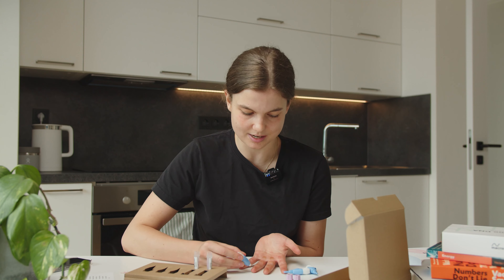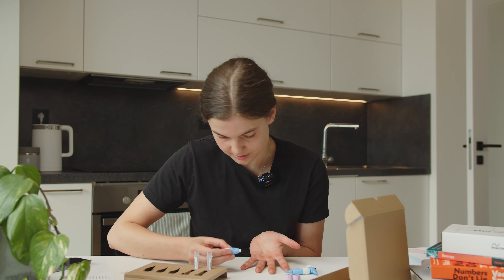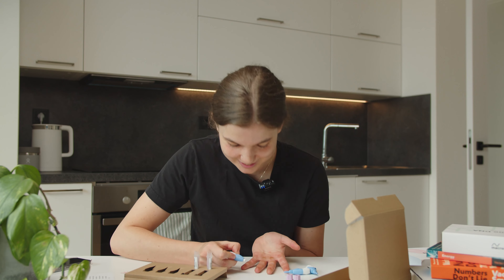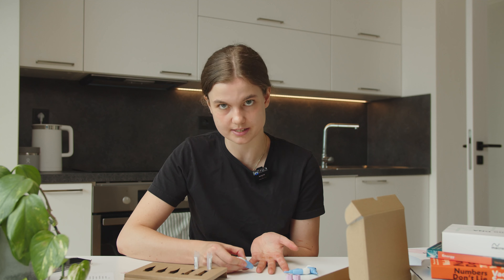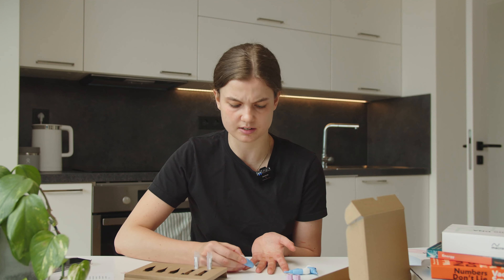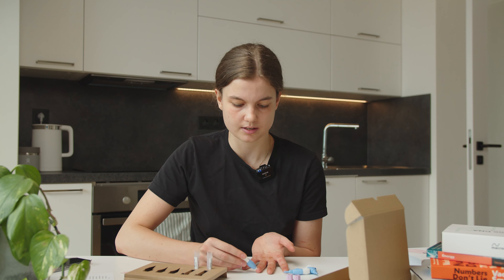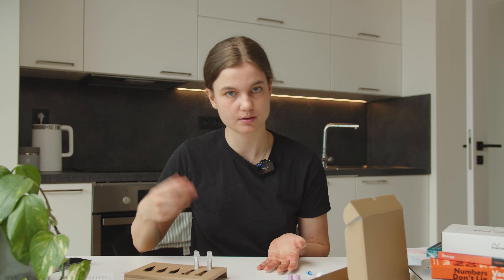I'm always a bit scared of things that move quickly, but the best position is to do it from the side of your finger and not too close to the nail, because if you do it too close to the nail it might go through and hurt. So I just gently place it and there we go — one went in nicely.